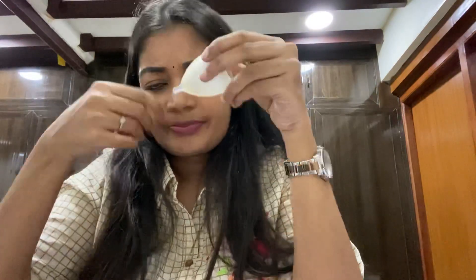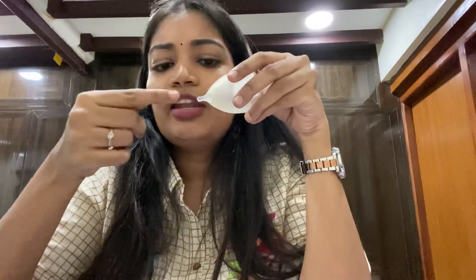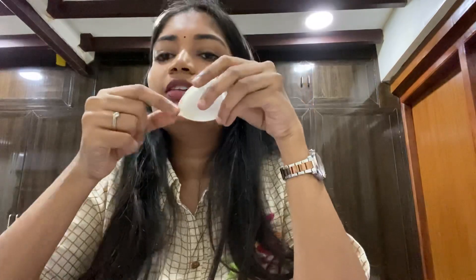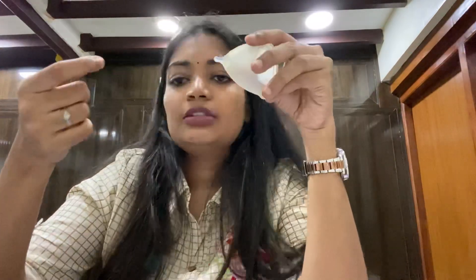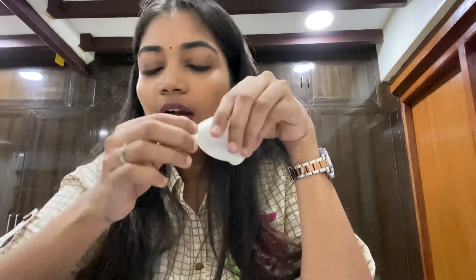If you have a stem that is uncomfortable, you can trim or cut the stem to adjust its length. Be careful not to cut too much, as it may be harder to remove the cup.